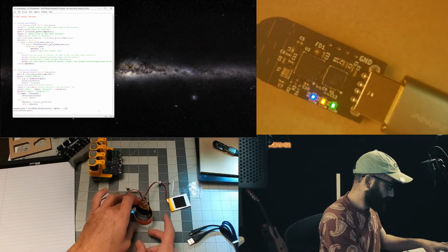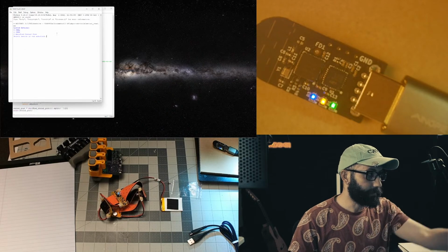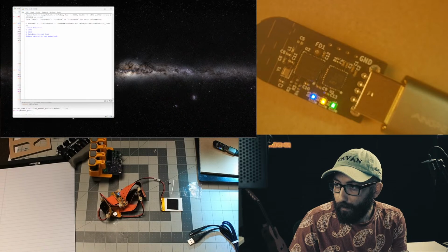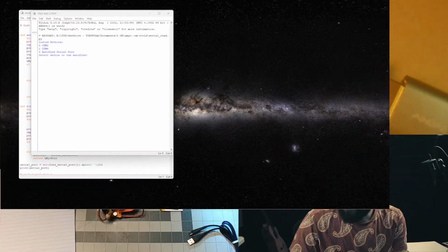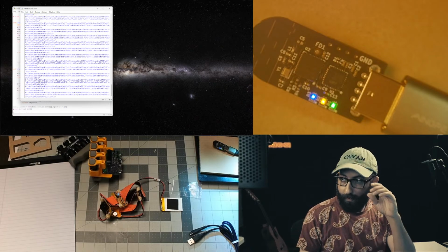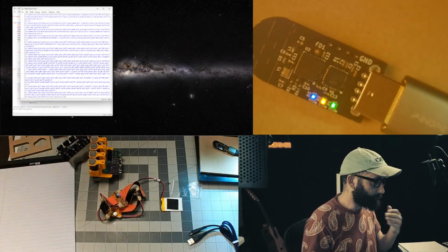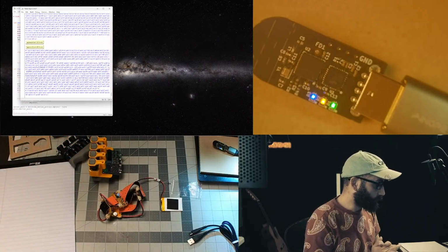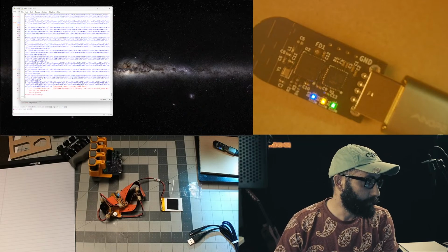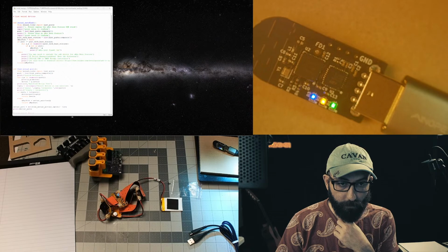Okay. So, now that we have this going, we should be receiving packets. So let's go ahead and go to serial read. We're going to run this, and it says it sees some COM ports listed here. You could probably barely see that. So I'm going to select COM port 6 by hitting 1, and it is receiving data. That's great. So it's getting the data from the uMyo. That's perfect. Now, the 3D6 did edit some code for this, so let's take a look at what they did. I'm going to go ahead and stop this. And let's open up my downloads, the new code.